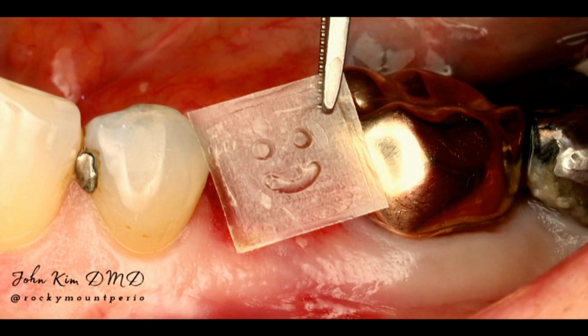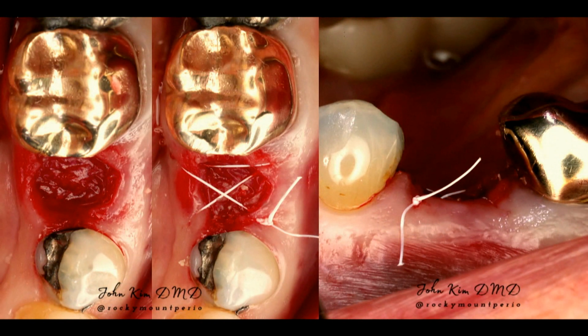And there's that smiley face, known as BioXclude. And gently tuck it in. And like Matt said earlier, the key is knowing how to use it the right way. So you want to use a dry instrument to bring this. Quite often with collagen membranes, we're hydrating it first, and then we're bringing it over. If you do that with this, you're going to learn the hard way that it's not going to be a fun procedure to do.